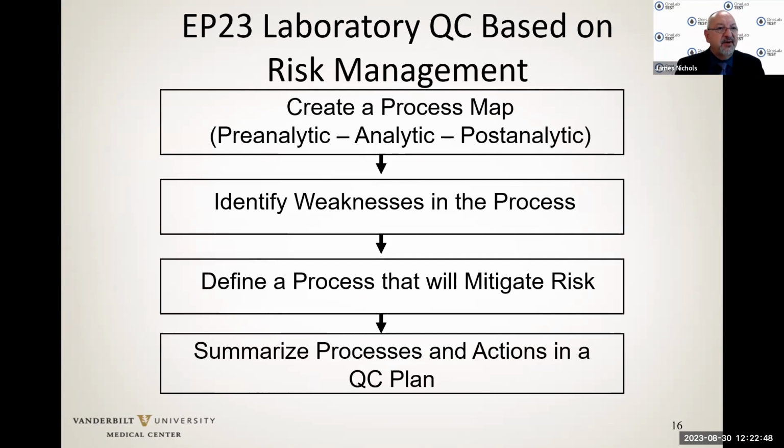So let's get started. We create a process map. We follow the test like we were a specimen, from order to specimen collection, the pre-analytic portion, getting that specimen onto the testing device, the analytic, and the post-analytic. Once an answer is available, how does that result get back to the clinician, and what is the clinical action taken?